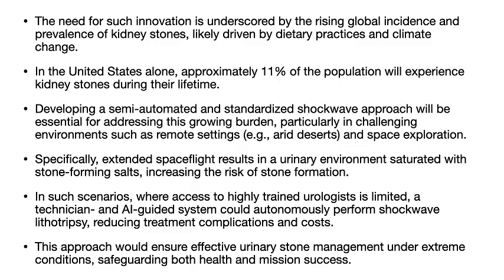Specifically, extended spaceflight results in a urinary environment saturated with stone-forming salts, increasing the risk of stone formation. In such scenarios, where access to highly trained urologists is limited, a technician and AI-guided system could autonomously perform shockwave lithotripsy, reducing treatment complications and costs. This approach would ensure effective urinary stone management under extreme conditions, safeguarding both health and mission success.